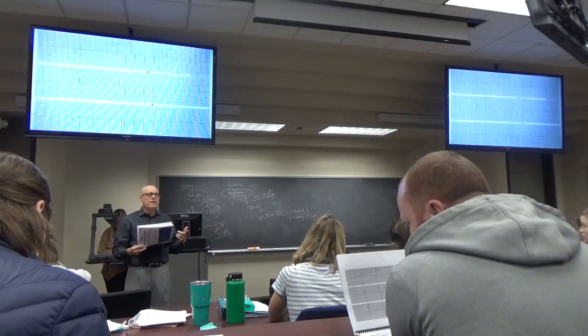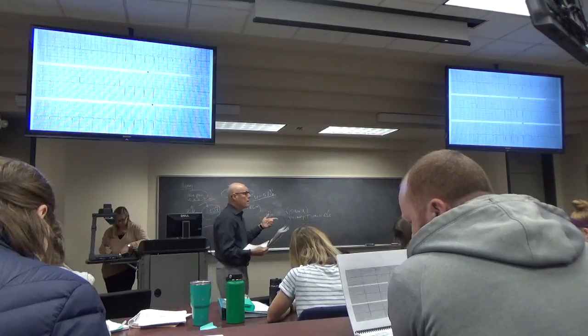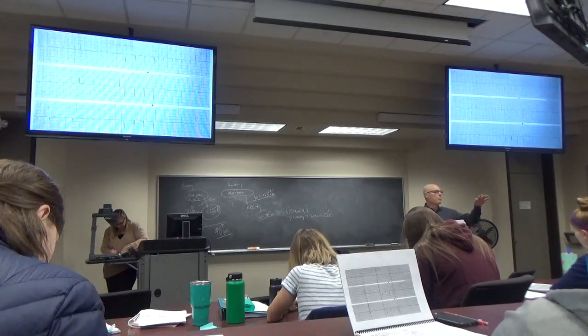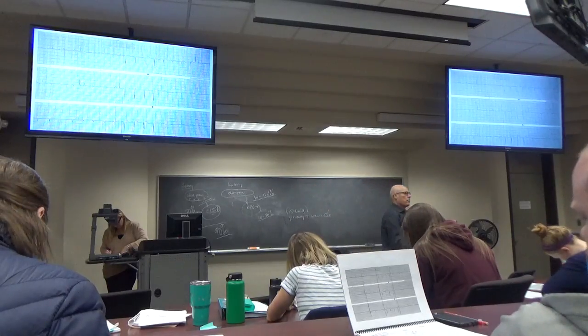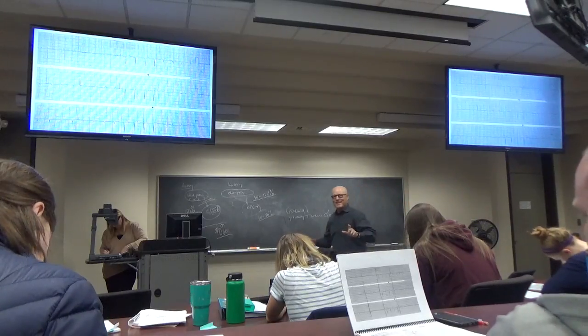There's one other finding. The T wave is upright. Yeah. In 2, 3, aVF, correct? Yeah. Either flat or upright. Okay, so let's use a little bit of, it's probably true. This is probably an acute anterolateral and probably an old inferior. And let's think about that just a minute.